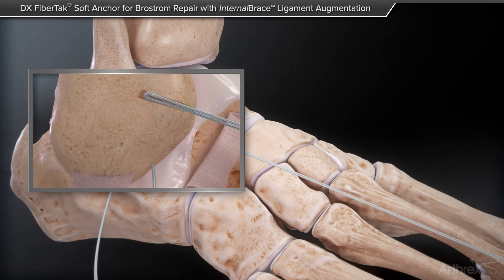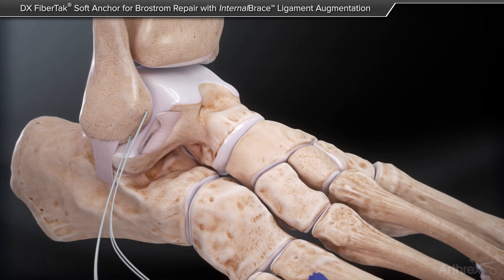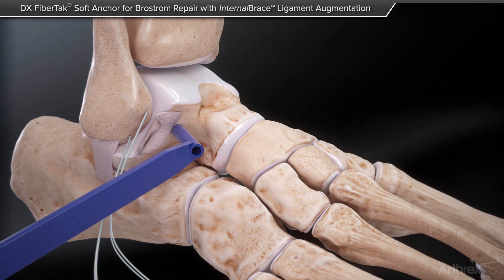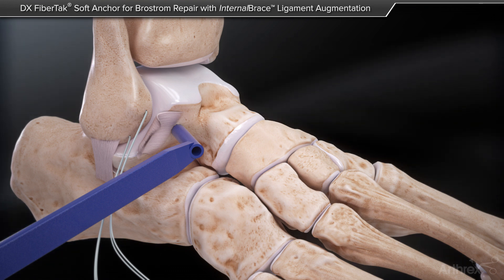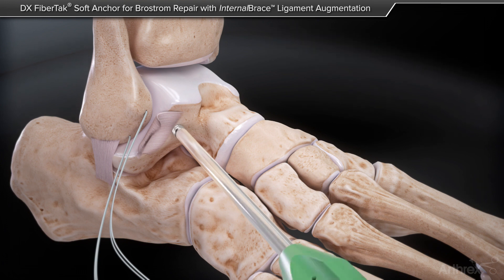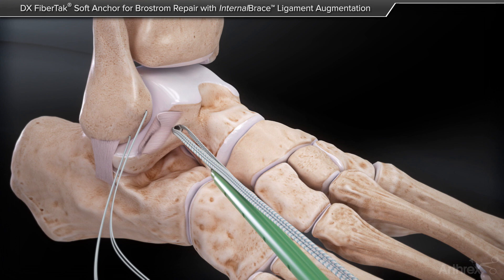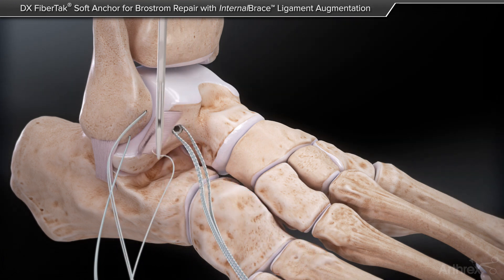After firmly setting the second anchor in the bone, the internal brace augmentation is performed. Prepare the talus by drilling with a 3.4 mm drill and 4.75 mm tap on the non-articulating surface of the talus at a 30 to 45 degree angle into the body of the talus, so as not to aim toward the joint space. Drill parallel to the bottom of the foot. Insert the preloaded 4.75 mm swivel lock and fiber tape into the talar hole and pass the fiber tape through the ATFL.